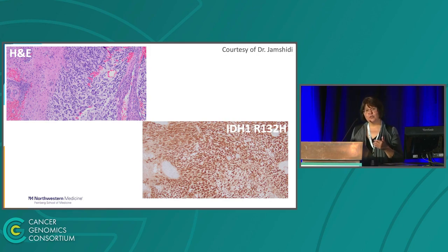And the case I wanted to show, where microarray analysis actually saved a lot of time and helped with diagnosis, was even more sad story. So this individual moved from a different country, and this, of course, was a second opinion case. All we knew is that there was a translation involved, the patient was a very poor historian, and all we knew is that there is a brain biopsy submitted for assessment.